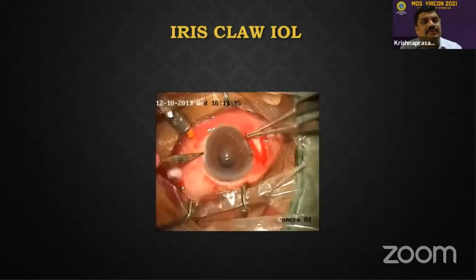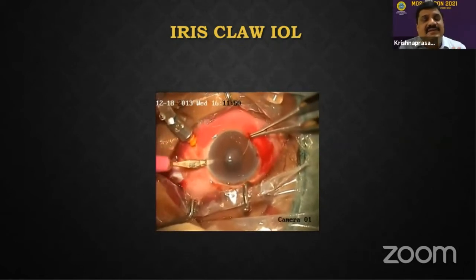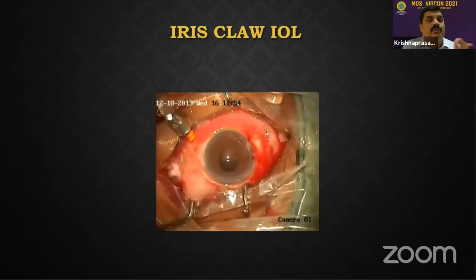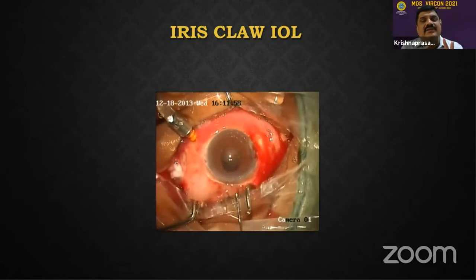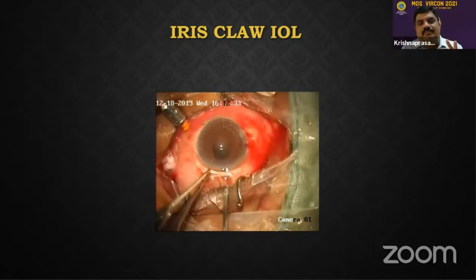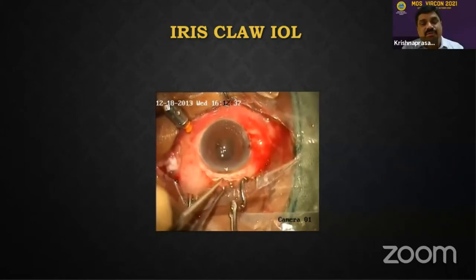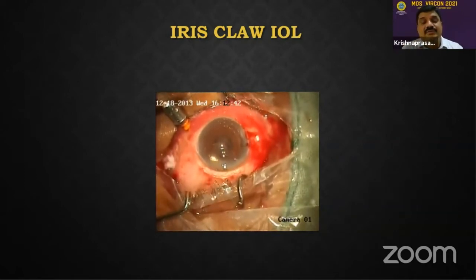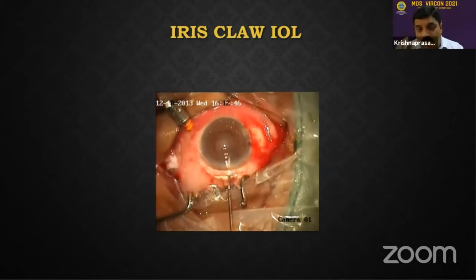Why I'm showing you this video? Most of us have a training center where you could see a lot of friends and junior residents. I think if you're good in this iris claw technique, it is one of the best lenses to put. Always put the viscoelastic. First put the lens over the iris, put a sufficient amount of viscoelastic in the anterior chamber. Then with the help of a special forceps, which is provided by the company, or you can order from the company, you can hold the lens.